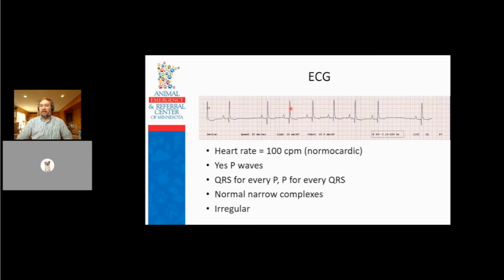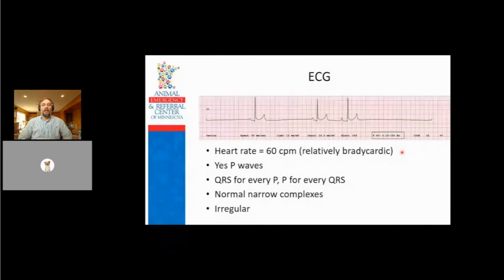And then we ask the question, is this hemodynamically or electrically unstable? And the answer is no. So, I think most of us would probably agree we don't treat sinus arrhythmias in dogs, especially if they're asymptomatic and doing well. Let's do the same thing.